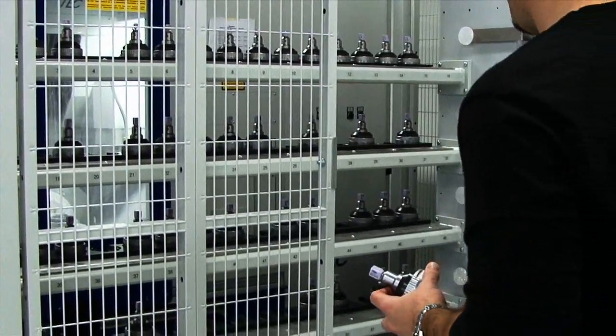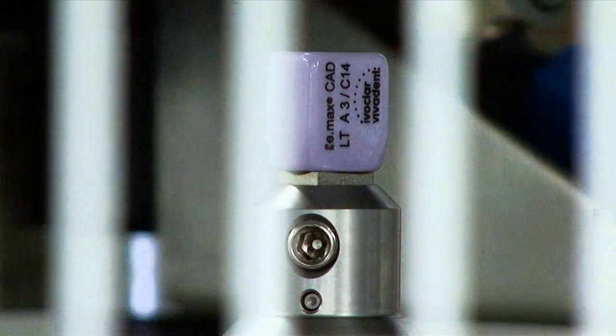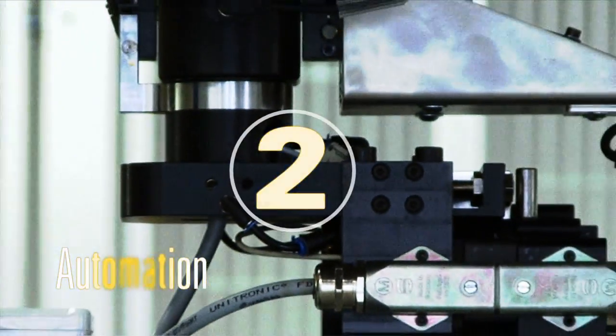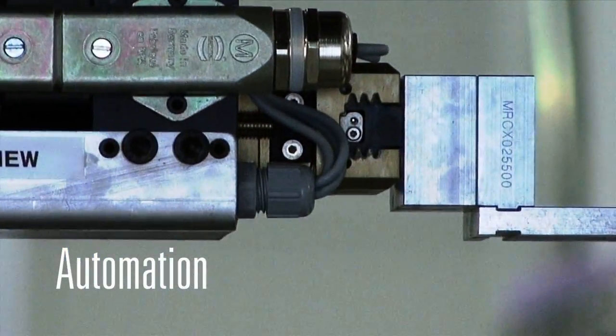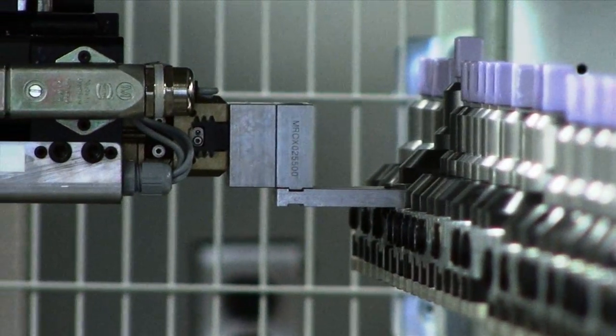The coated mounts are loaded onto the automation rack. The robotic arm takes the mount and transfers it into one of the industrial milling chambers.